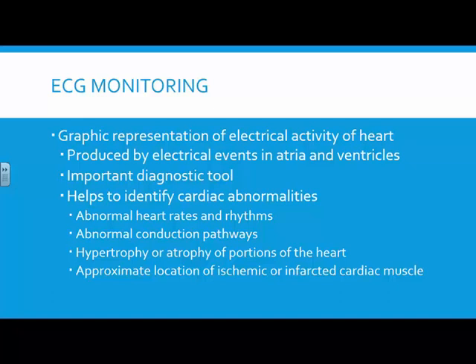We can do 12 lead where we can get several different looks. We can do lots of things with it, but what we cannot do is get a representation of the mechanical function of the heart. An ECG monitor is solely for the monitoring of the electrical function. We cannot get a representation of the mechanical function.